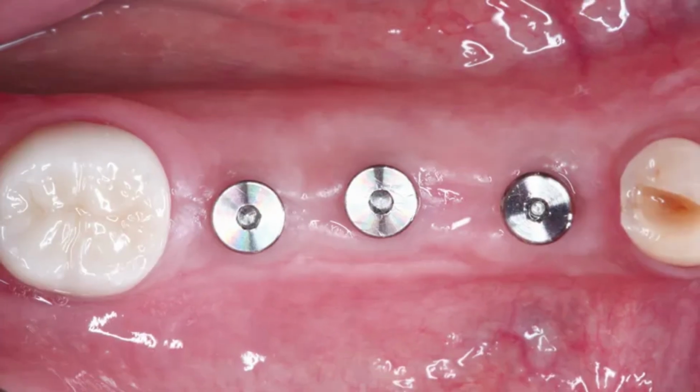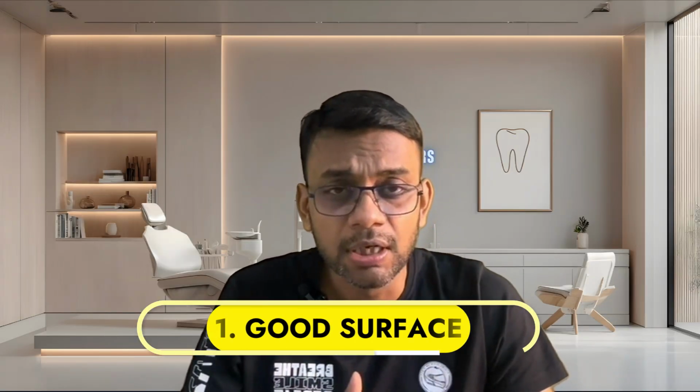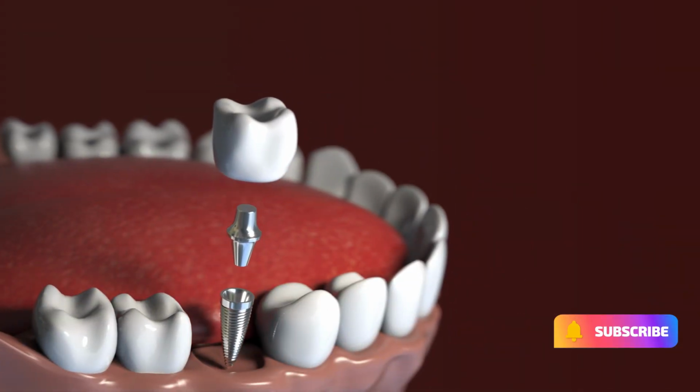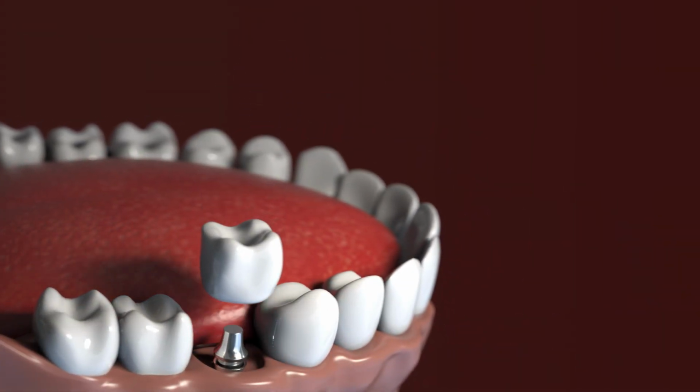Whatever implant you select, it should have a good surface. Now what do I mean by a good surface? The surface of the implant should align with your treatment goals. If you're placing an immediate implant, the surface should be active. It should be able to engage the walls of the socket. If you're placing a delayed implant, you don't need a lot of torque, then it should be a passive implant.